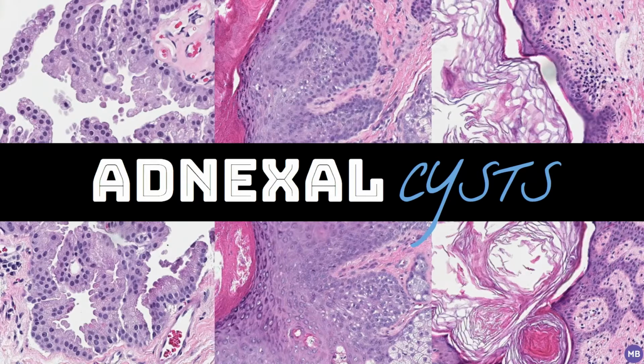In this video, I'm going to be discussing a variety of adnexal cysts and cystic adnexal tumors. Before we get started, I just want to remind everyone that I provided links to the whole slide images of the cases we're about to go over, and you can find those in the video description.